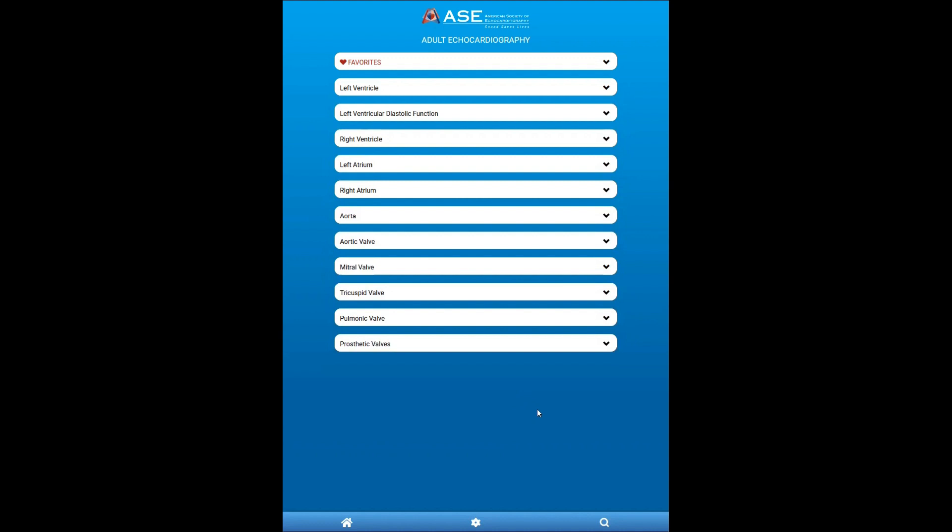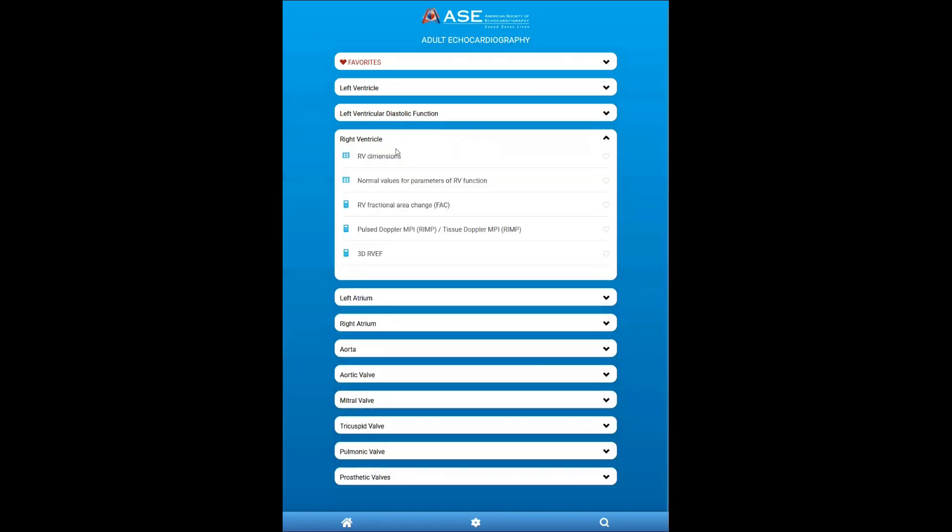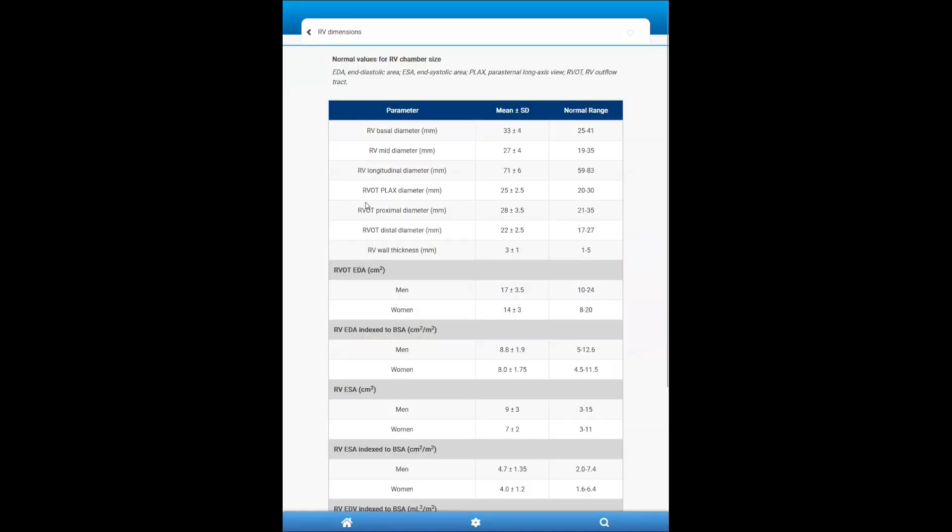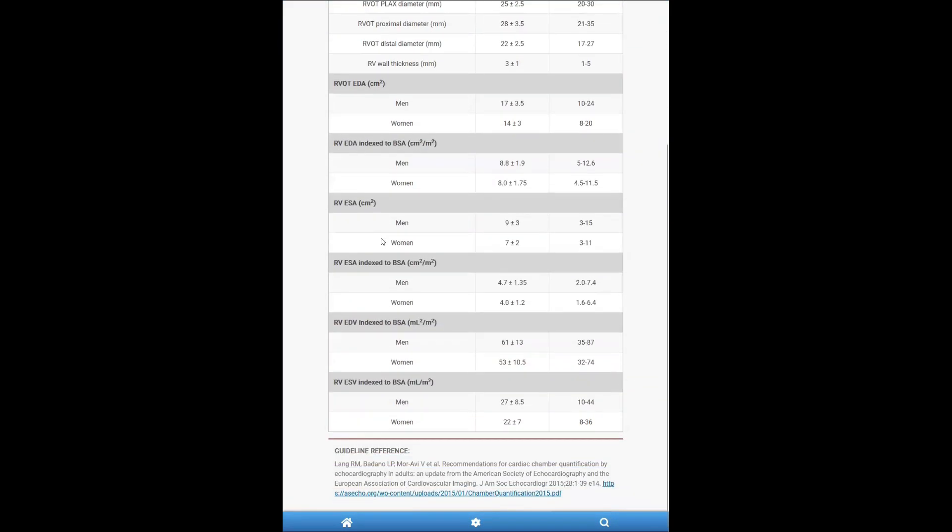If all you need is a table to reference normal values and you want to quickly access it, let's say I need to recall the right ventricle dimensions, you will click here and anything that is a reference table is indicated with this icon. And it will pull the normal values and everything has a guideline reference at the bottom.